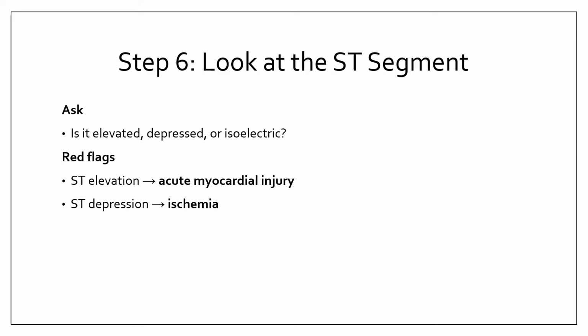Another red flag is ST depression. ST depression typically indicates myocardial ischemia, can be caused by reduced oxygen supply or increased oxygen demand. It can be transient or it can stay persistent.